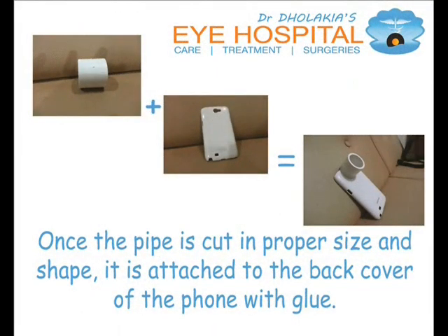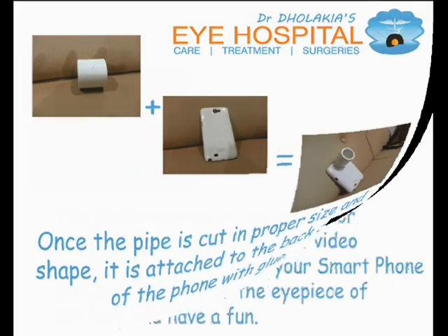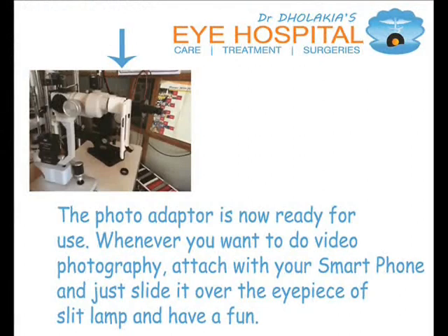Once the pipe is cut in proper size and shape, it is attached to the back cover of the phone with glue. The photo adapter is now ready for use. Whenever you want to do video photography, attach it to your smartphone and just slide it over the eyepiece of the slit lamp and have fun.